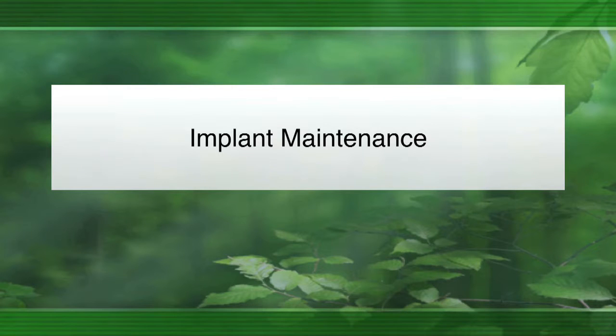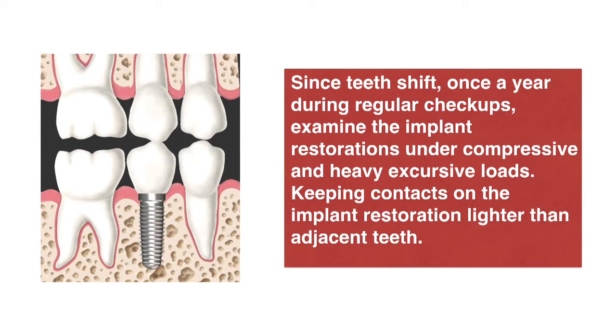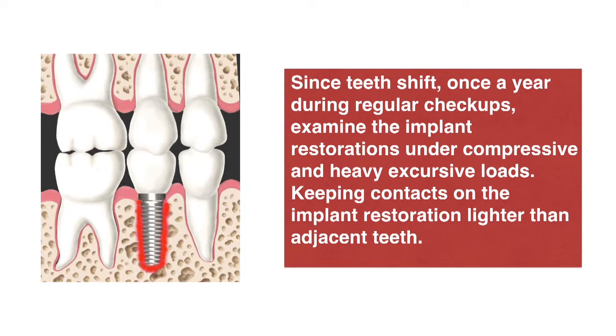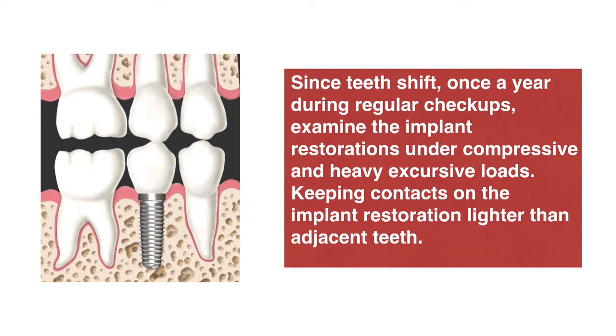All right, implant maintenance is the last part we're going to talk about. So since teeth shift, once a year during regular checkups, examine the implant restoration under compressive and heavy excursive loads. Make sure the contacts are still light. The opposing tooth may drop down a little bit and begin contacting harder than it had before. And so just check those bites every once in a while. Make sure that you're checking the occlusion. Make sure it's not changing and hitting in different ways than it did before. So again, things shift over time. You want to check those occlusions of your implants to make sure it's light and still functioning without heavy forces on them.